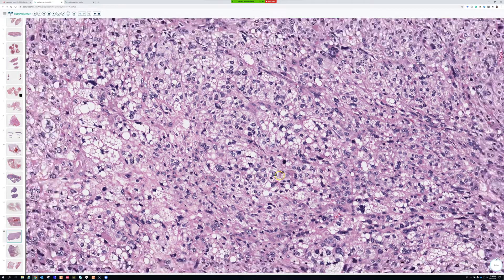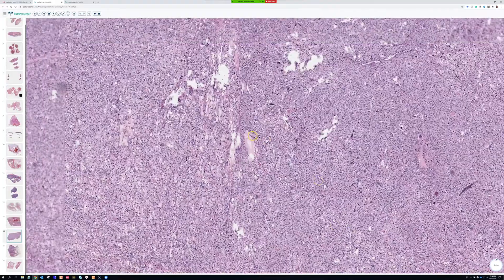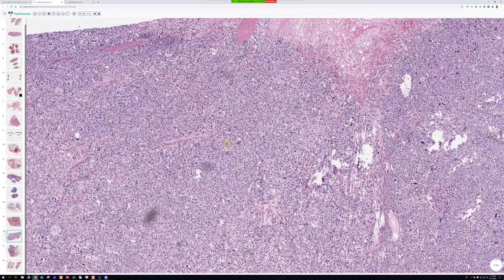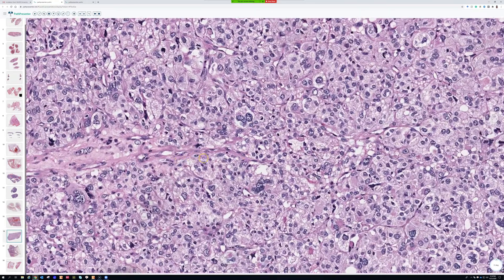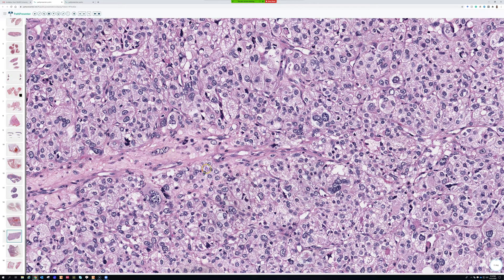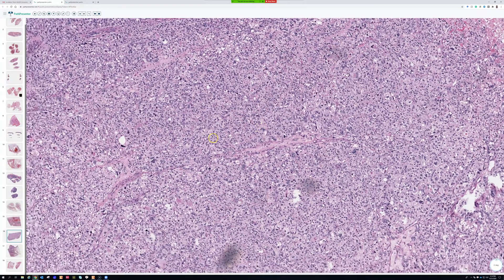Sometimes you can have both areas together — epithelioid transitioning into spindle. I feel like the nuclei of pleomorphic liposarcoma are among the most ugly, massive, pleomorphic nuclei of any tumor in the human body. When I see a sarcoma with super bizarre nuclei — stuff that makes this look tame — I always hunt extra hard for lipoblasts, even though it's not a formal diagnostic criterion.